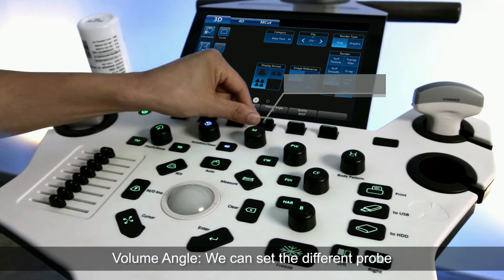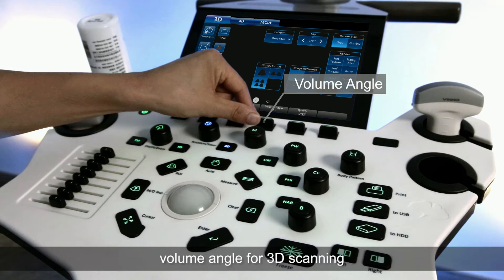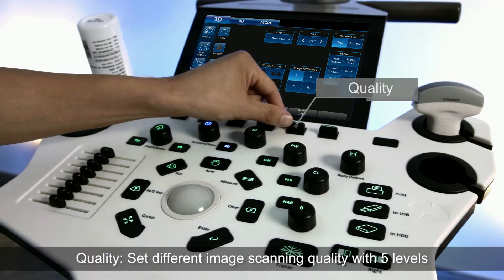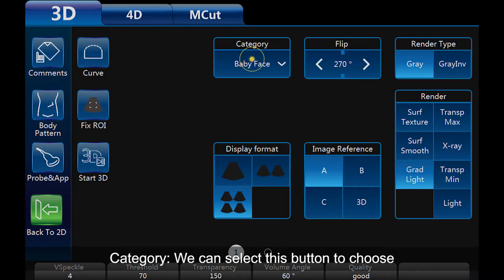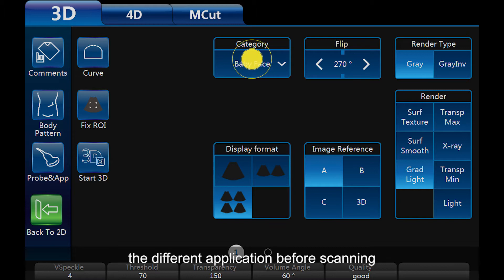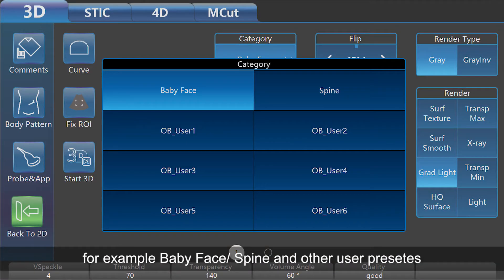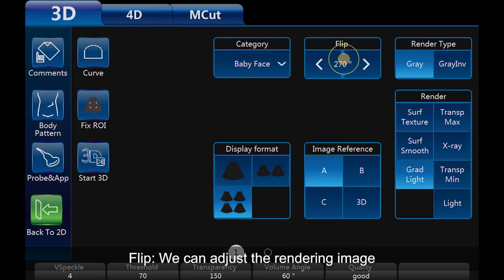Volume angle: we can set different probe volume angles for 3D scanning. Quality: set different image scanning quality with 5 levels. Category: we can select this button to choose different applications before scanning — for example, baby face, spine, or other user presets.